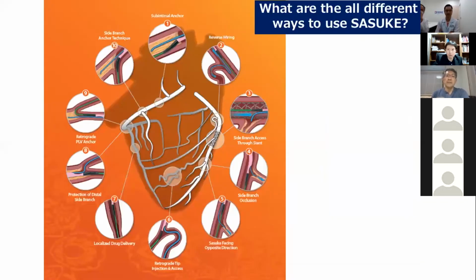You can apply the Sasuke to many applications like I already presented. And the last is maybe the newer technique that Dr. Kinoshita has presented, to use the new technique together with the IVUS guiding. Thank you very much.